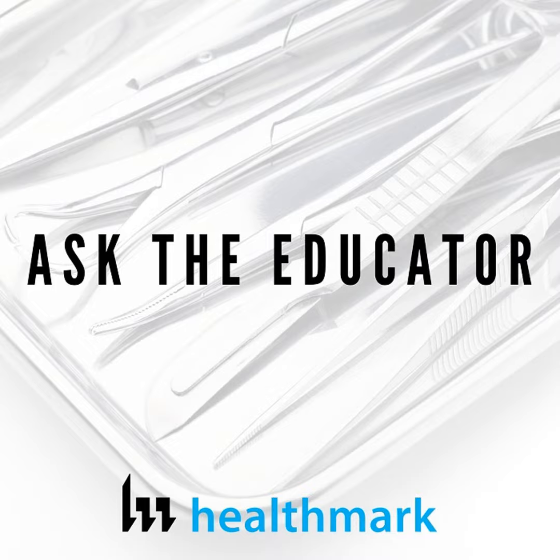So we need to identify gaps in the training, find out, are we doing it correctly? Are we training correctly? Are we doing it thoroughly? Are we doing any audits on our own shavers? Take them off the shelf, check and see. And then if they're dirty, go back to the technician and have them demonstrate their practice and try to get to the cause of this problem, not in a punitive way, but in a way that you're actually coaching somebody on how to get where they need to be with such an important device.